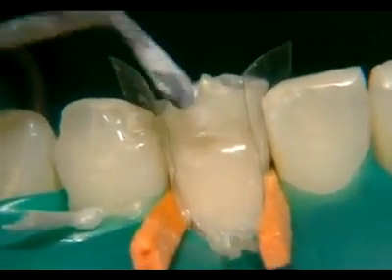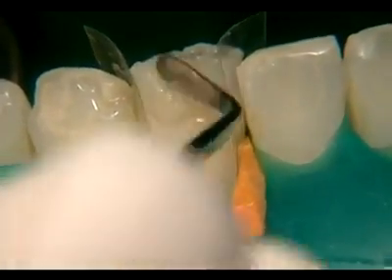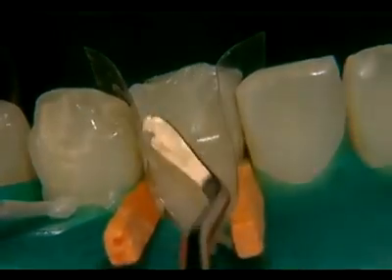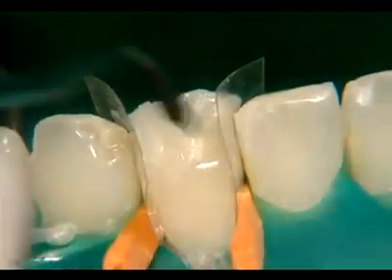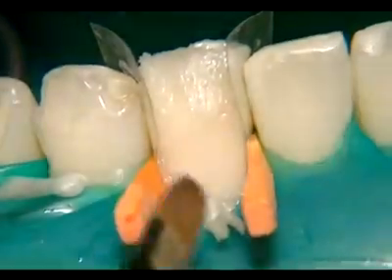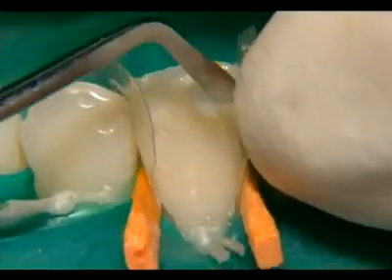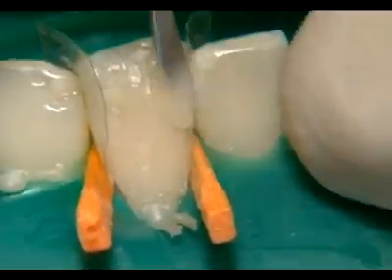Next, another thin increment of the enamel material selected is applied to the vestibular aspect of the tooth. Then this layer is polymerized. The vertical ridges are built up with clear enamel material to increase the stereoscopic effect of the restoration. The layers are polymerized individually.